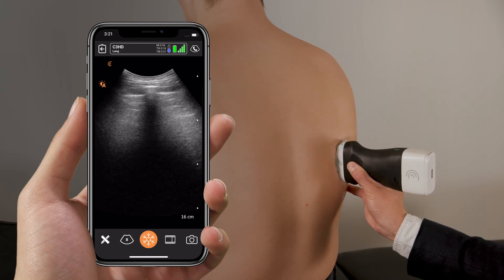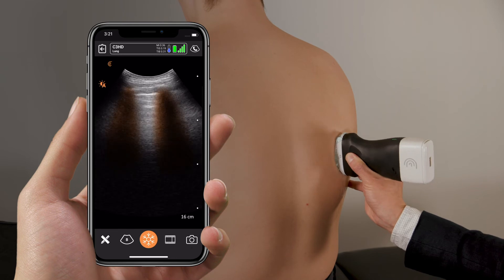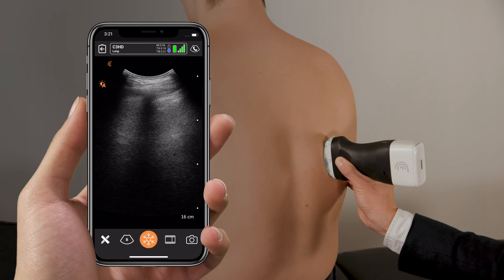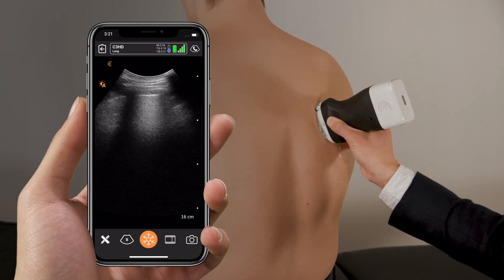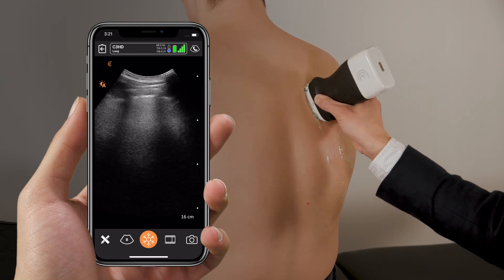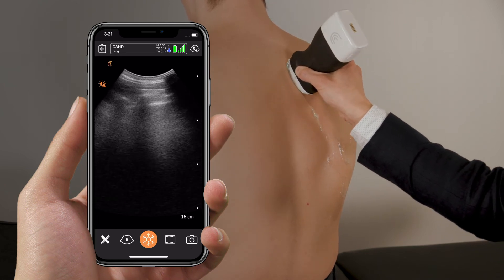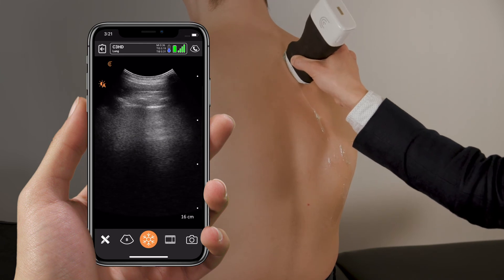Again, slide upwards and look for our typical landmarks of our ribs with the pleural line in between. We can see normal sliding with A lines. Interrogate as much of the lung as possible as you slide up towards the upper lung fields. We want to maintain our scanning approach perpendicular to the pleural line.